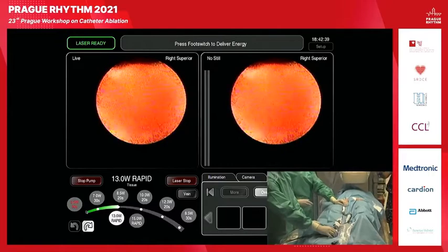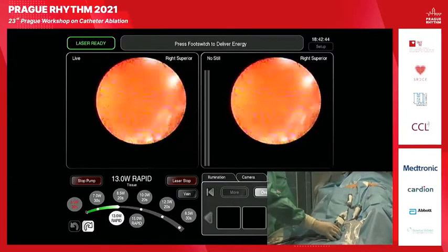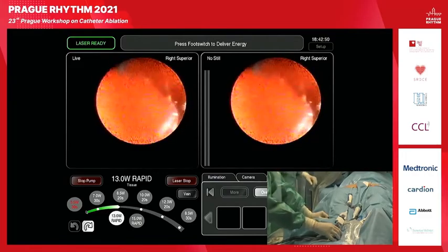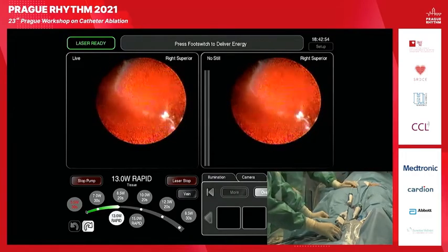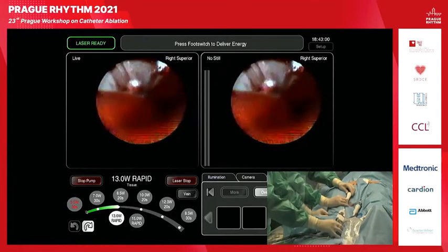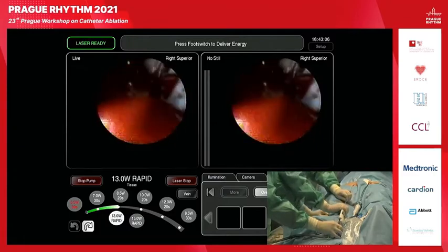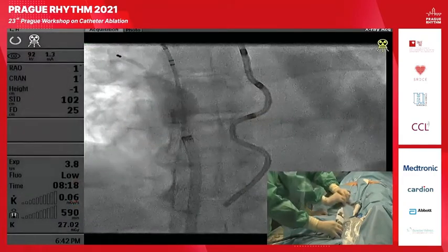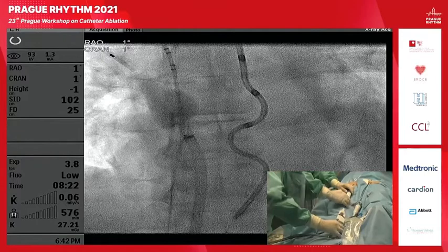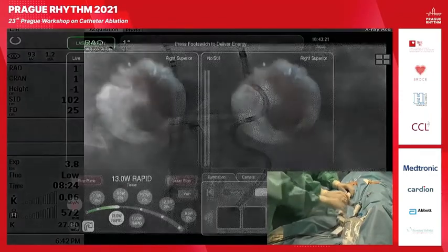So first of all, we need to inflate the balloon. As I explained, do we have the screen of X-ray? Push the button of the fluoro, actually the button of the catheter, and please show on the fluoro. I will give fluoro live. We don't like too much fluoro, but just to show you how nicely we are inflating the balloon. And there's a marker on the shaft indicating the orientation of the shaft itself. So now on the laser screen, you can see very nicely the contact creation.